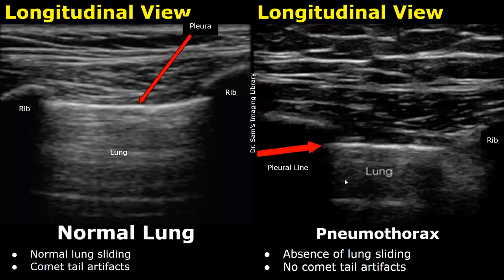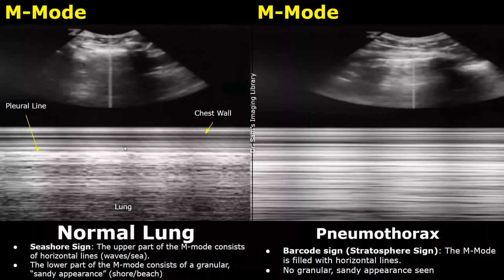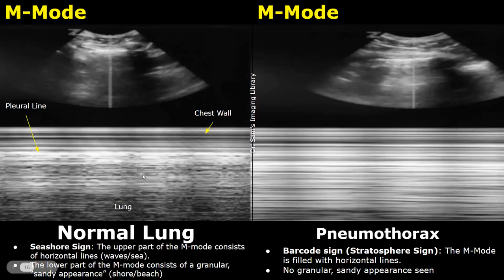This can be further assessed on M-mode. In a normal lung, after M-mode is applied, a seashore sign is seen. In the M-mode tracing, the upper part is the chest wall where horizontal lines are seen, and the lower half is the lung tissue, which consists of a granular, sandy appearance.